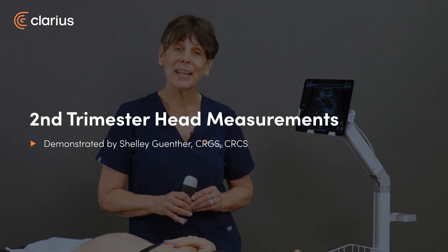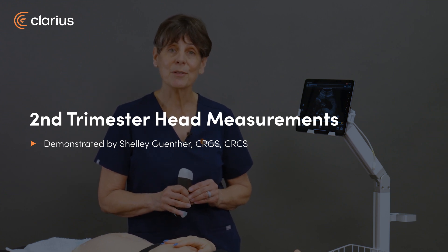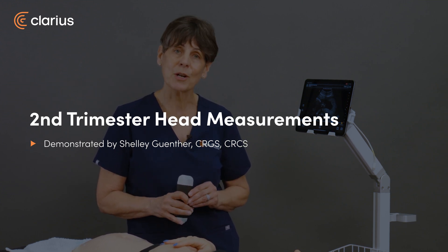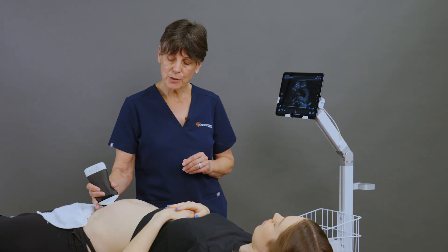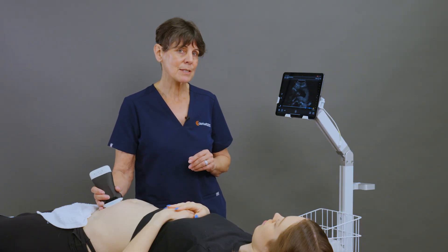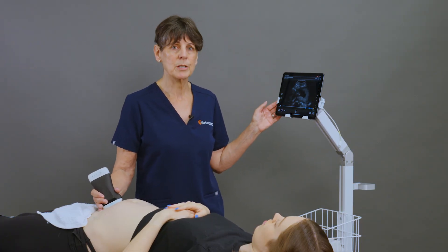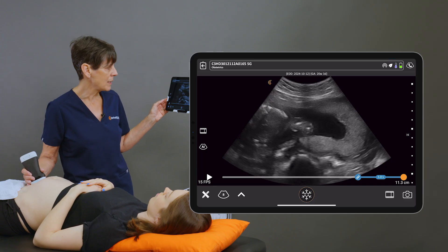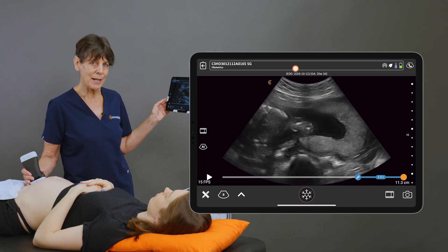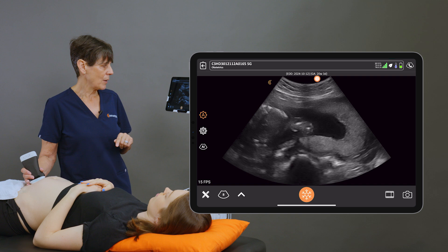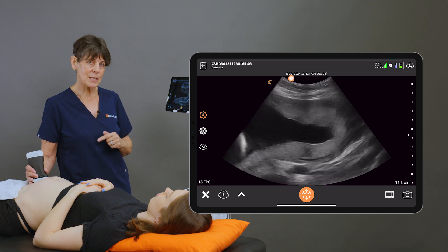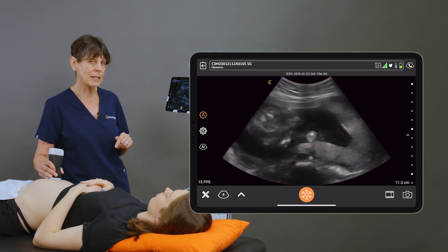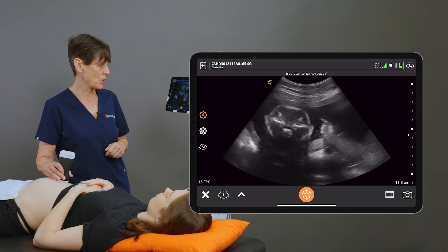Hi, my name is Shelley and today we're going to talk about fetal biometry measurements of the head in the second trimester. I've entered my patient's due date according to her dating ultrasound and today she should be 20 weeks and three days. I'm using the C3 scanner in the obstetrical preset, which is going to give me access to do the head measurements.